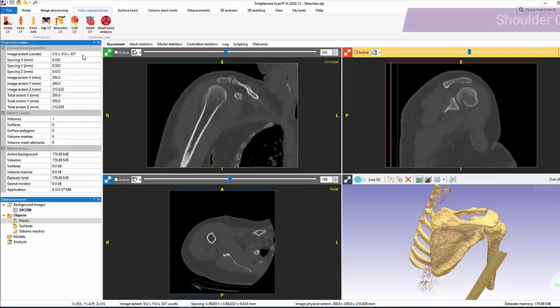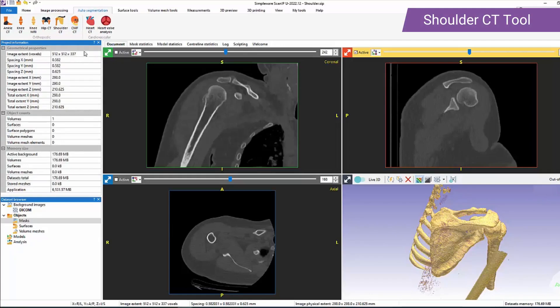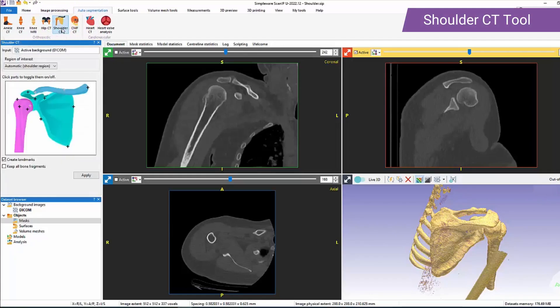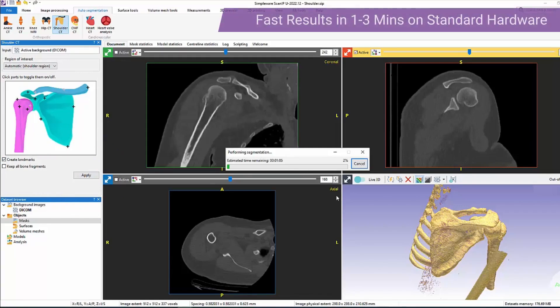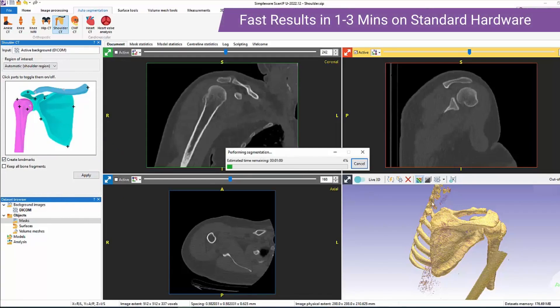I'll now demonstrate how to run these tools in the GUI using the shoulder CT tool. We simply click on the desired tool, modify the options discussed previously if necessary, and then click apply. This tool runs in one to three minutes on standard hardware.